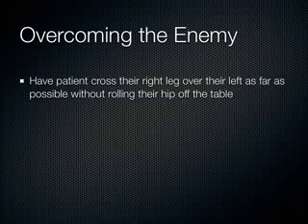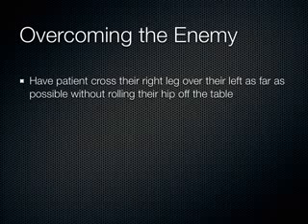So how do we overcome the enemy of bowel gas? Well, the first thing I do is have the patient cross their right leg over their left leg, and we'll do this today with the models.